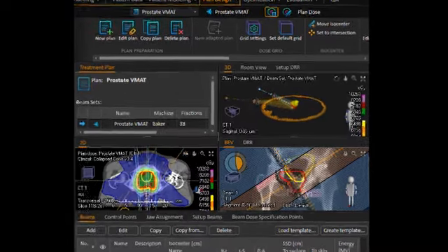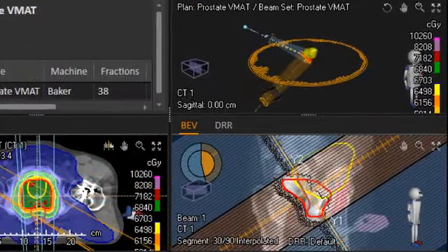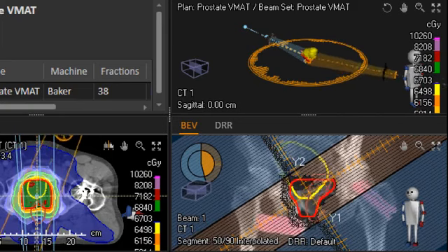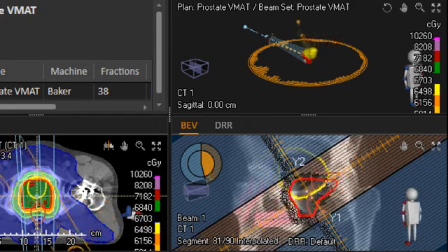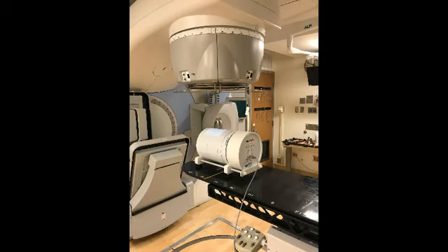As you can see here, you're rotating around the patient with this VMAT plan, and you can see the small segments as the arc goes around the patient. So you can't just visualize it on a patient like you did with a 3D conformal plan. So you have to have some alternative method. The technique that's developed has been to verify it on a phantom device.